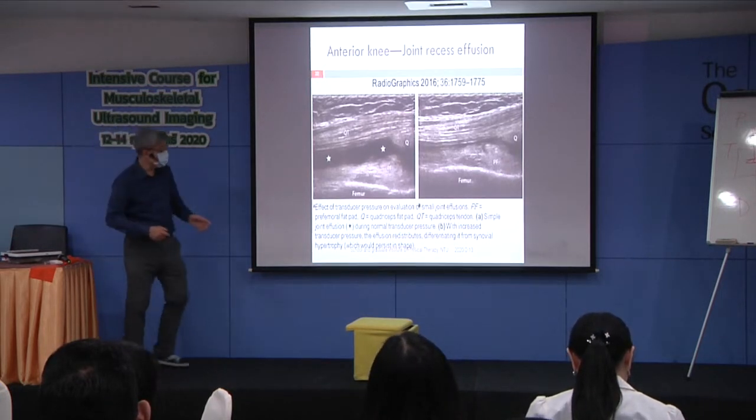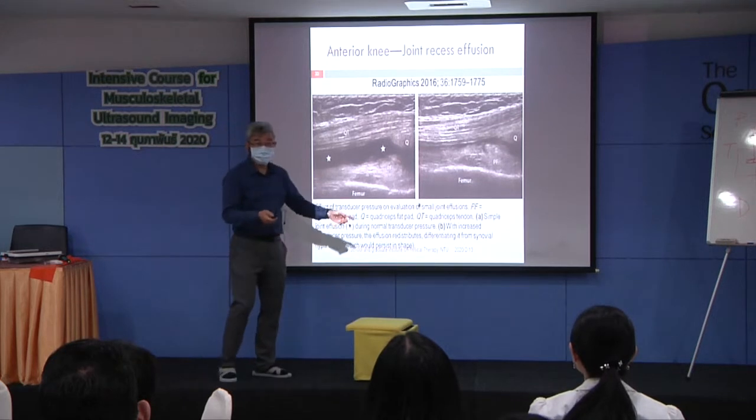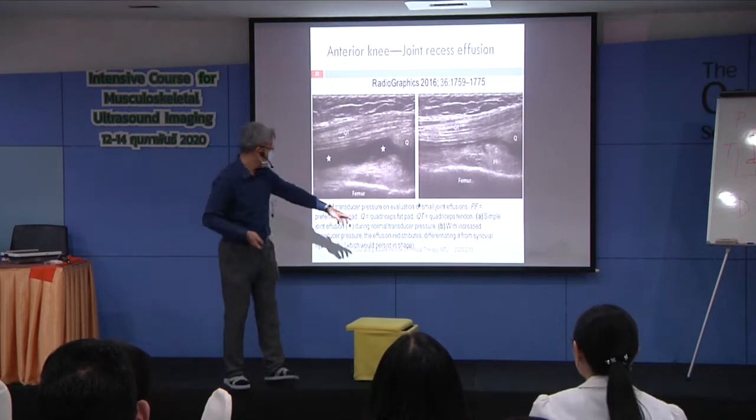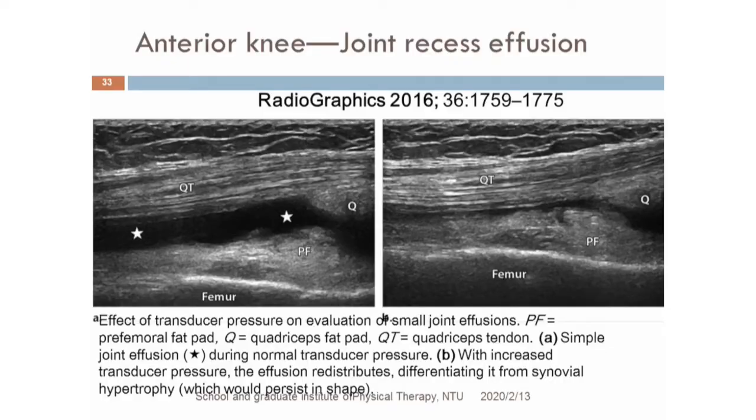Then you look at the joint for effusion. I think the lady at this table, yes, has very mild, right? Very mild effusion. So if anyone shows these symptoms, it's a very good opportunity to test your hand sensations.